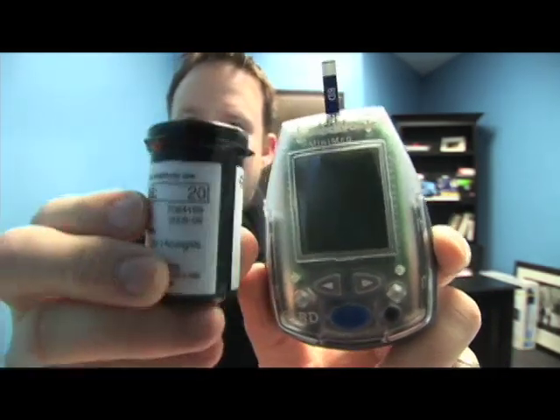Last but not least is the blood glucometer, which actually makes these little test strips work. Once it turns on it will match a code — 20 — which matches this little number that also says 20. I've never had a code come out to 666, but there are times I feel like that little machine is possessed, what with the beeping all night long.